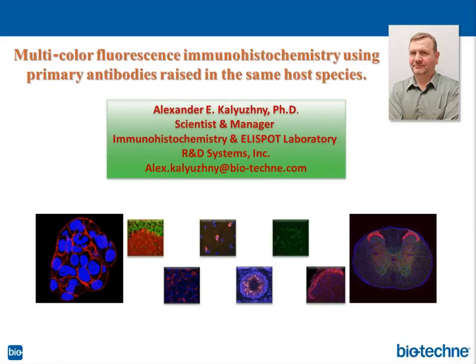They're doing multicolor for pathology diagnostics, and unfortunately, it's so new. The whole technique is in its infancy, and there are no papers available, but you can contact this company and ask them directly how they do it and if they want to do it for you. Of course, given that you will use our antibodies made by R&D Systems, they will conjugate them for you, and you can use anti-Hapten secondary antibodies.